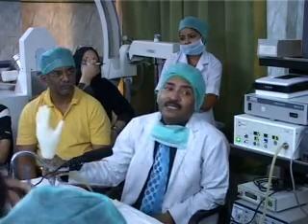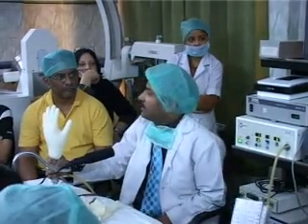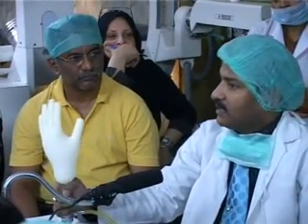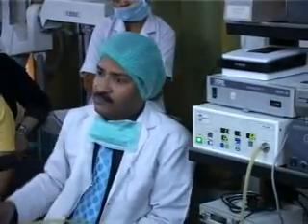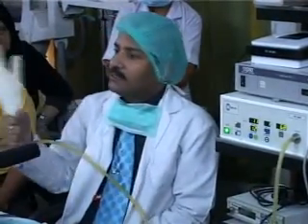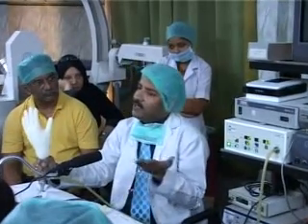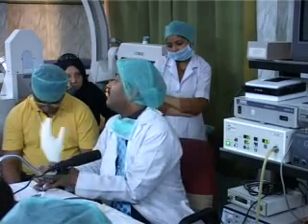So if your insufflator is 40 liter, it can replace a leak of up to 40 liter per minute, isn't it? If it is 9 liter, then maximum it will replace 9 liter per minute. And when your cannula is in, you should keep it at the maximum flow rate, like 40, or if you have the bar, increase it. Here it is 0 to max. 0 to max means if it is required, it can go up to the maximum, and if it is not required, it will be 0 also. Automatically the insufflator will decide what the flow rate should be.